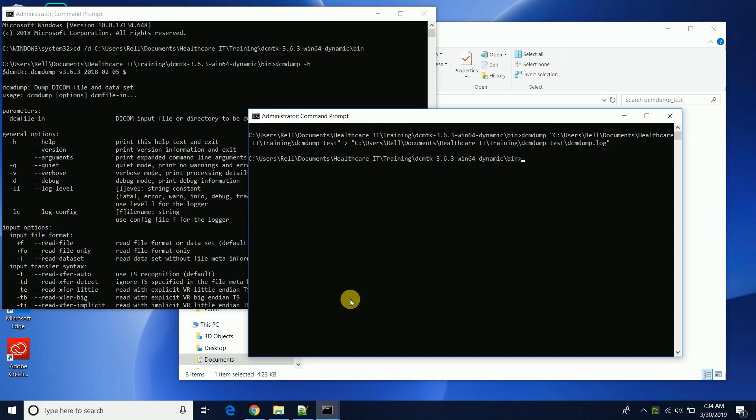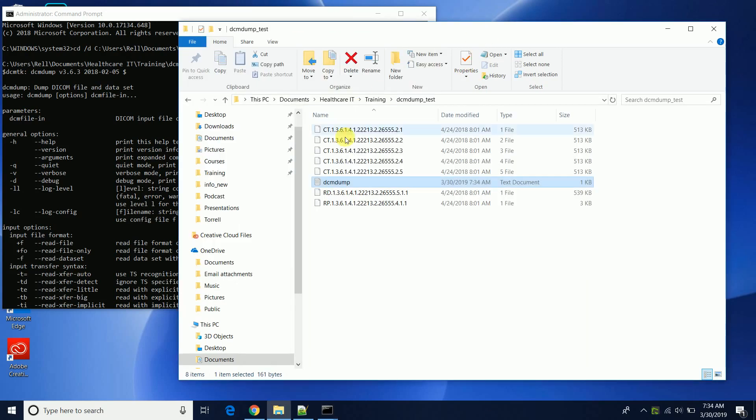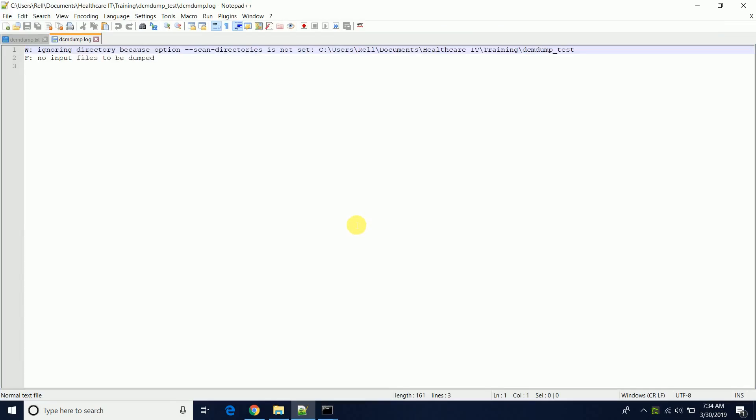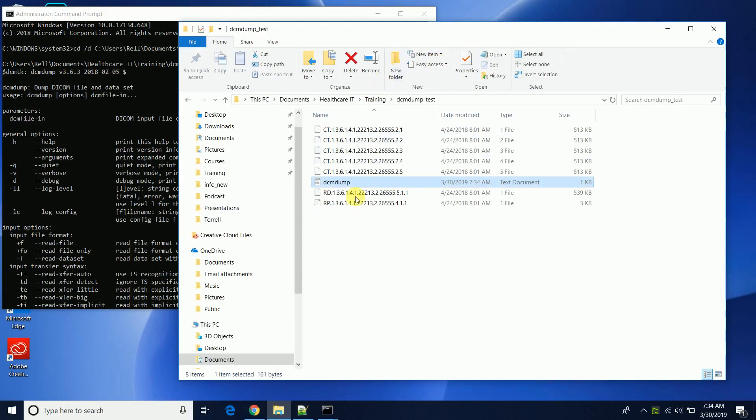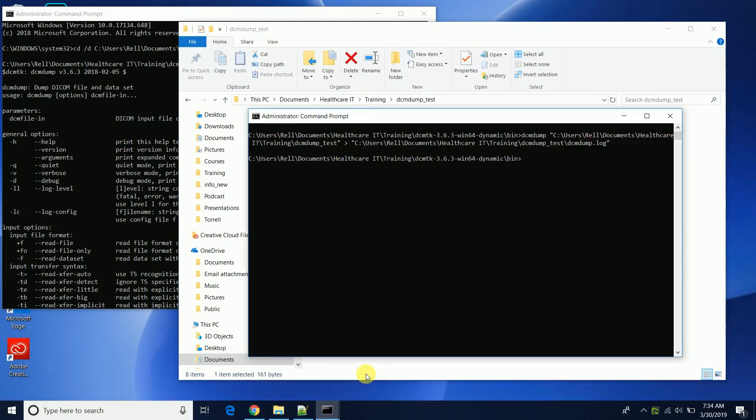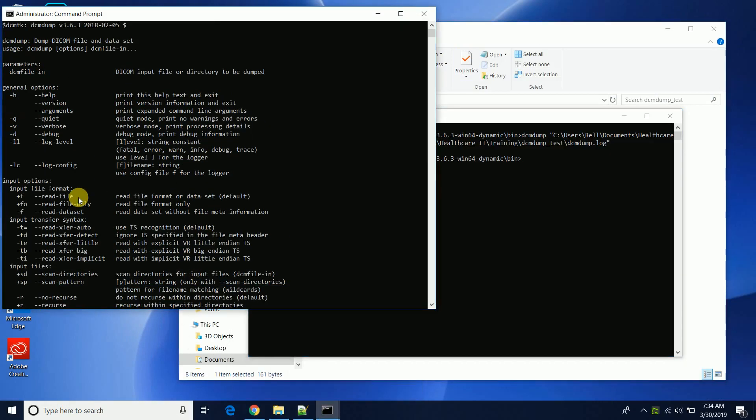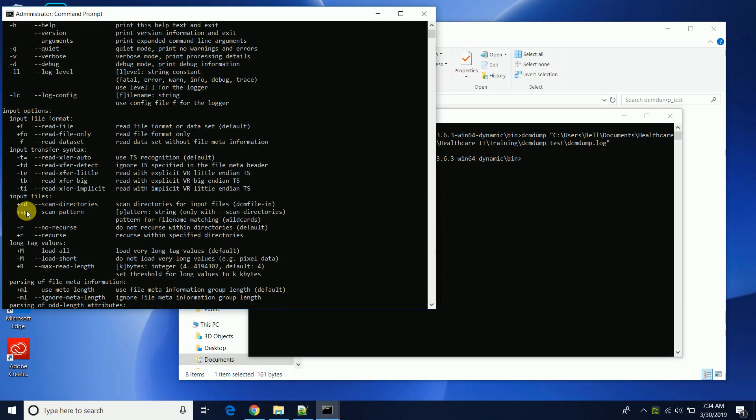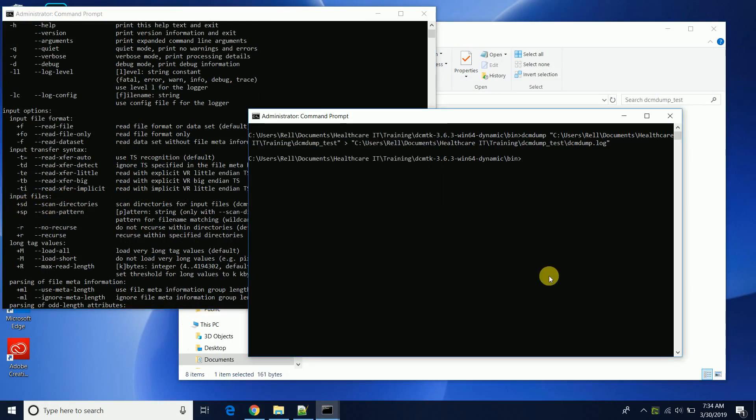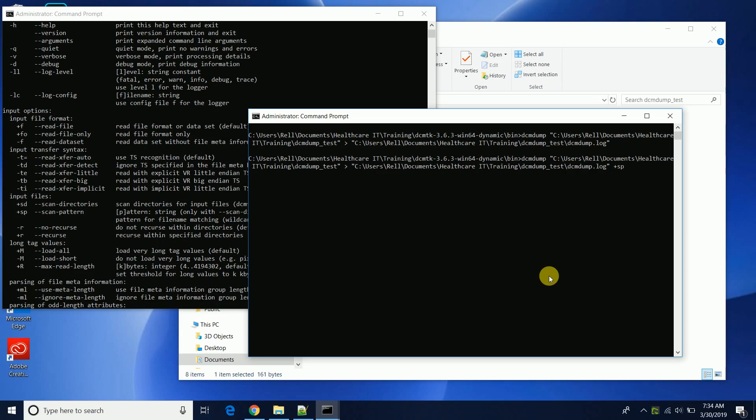Dump that to a file. And now if we come back and look at the contents, the file scan directories is not set, ignoring. So we need to add the option scan directories. If we come back here, we need to add the option scan directory. So scan directory.